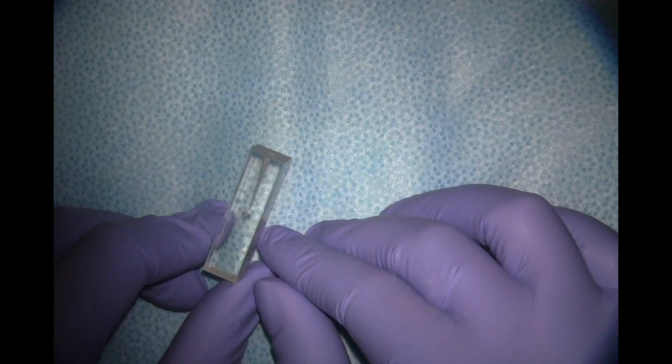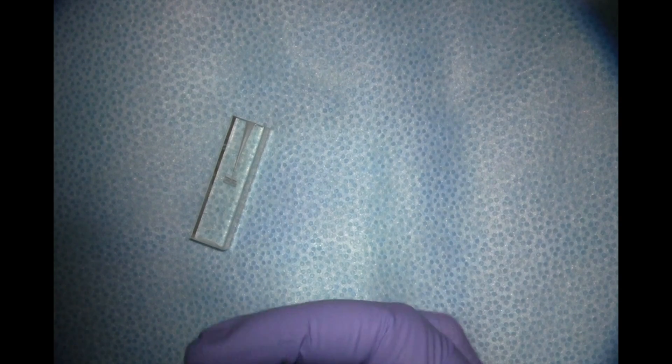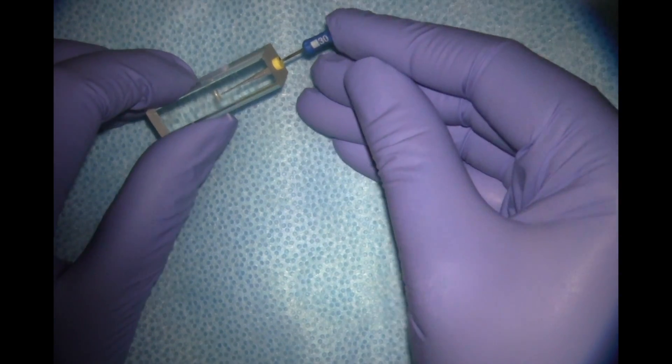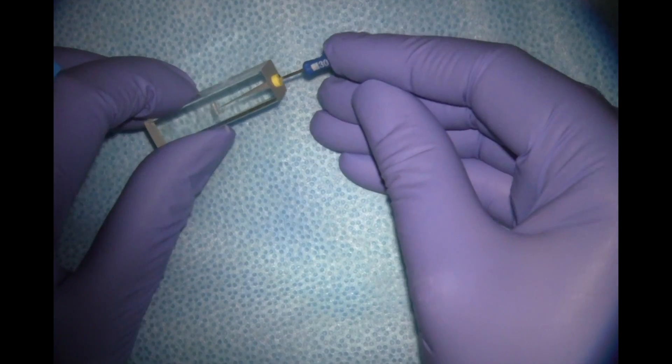The first thing I'm going to do before obturating or sealing the tooth is to make sure I have a good seat by placing my MAF file — my 30 file — at my corrected working length of 16, making sure that it seats to length easily and doesn't move apically with light apical pressure. That feels good here.